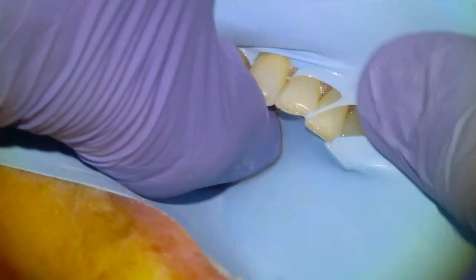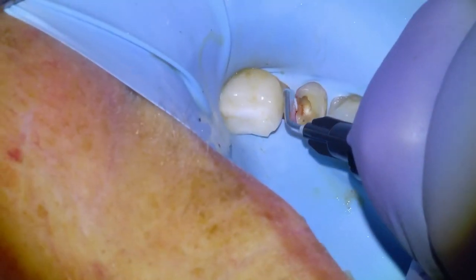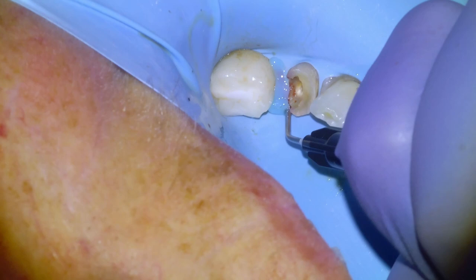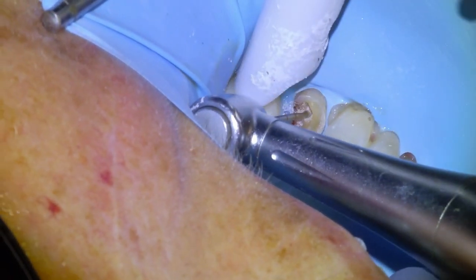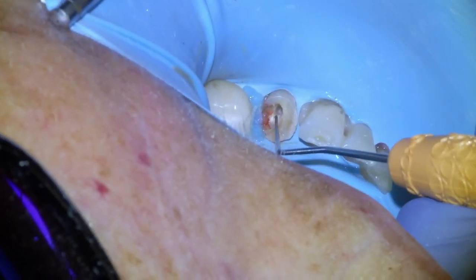I'm going to put on a rubber dam now that we're ready to start the root canal proper, and I'm going to place some block out. This is just liquid dam — light cure it — and then I'll use a Munce Discovery burr to discover the orifice.